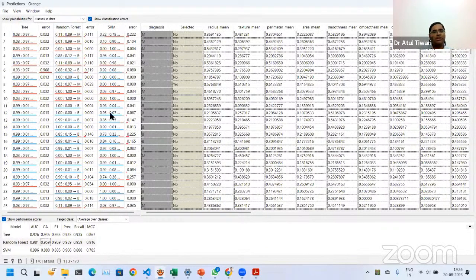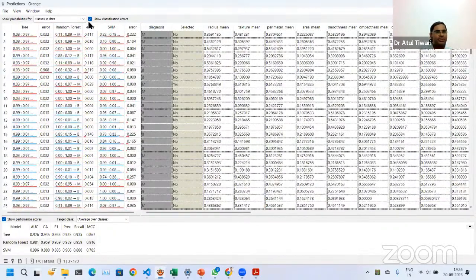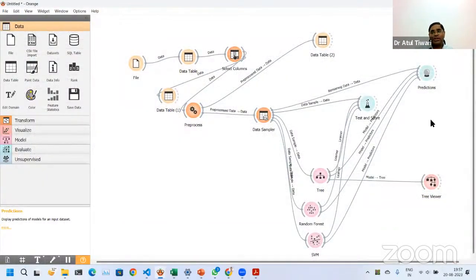In the same way, we can see all the values of the 30% data set on which it predicted. We can also inspect where the machine is failing to diagnose, and analyze why this AI model is failing to predict our diagnosis. If we find the cause, we can work on the solution, and ultimately it will make our model better. So that's how we create a basic model.